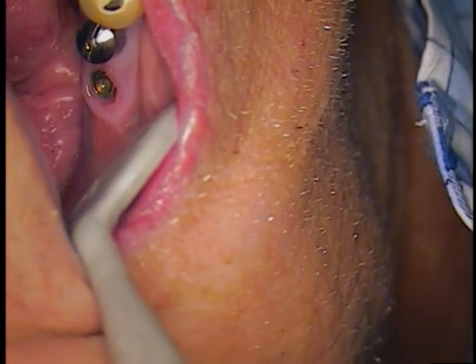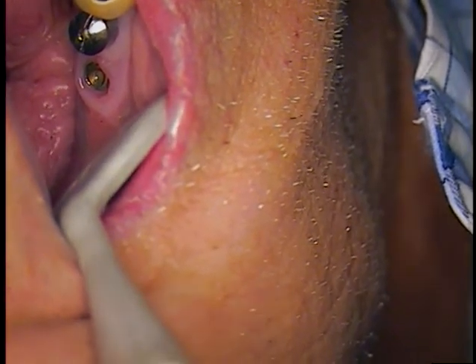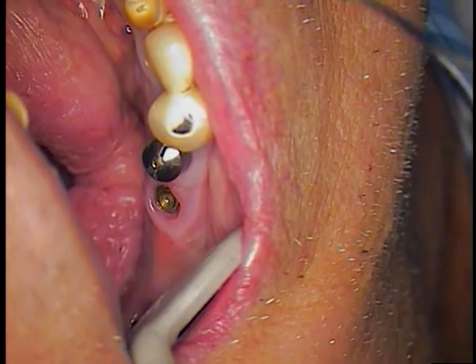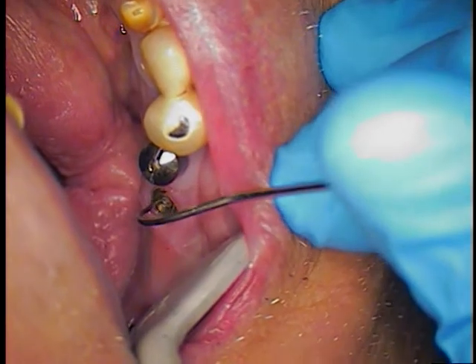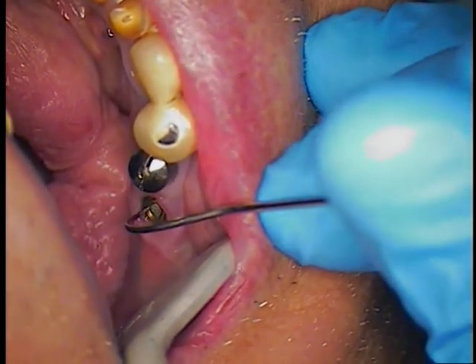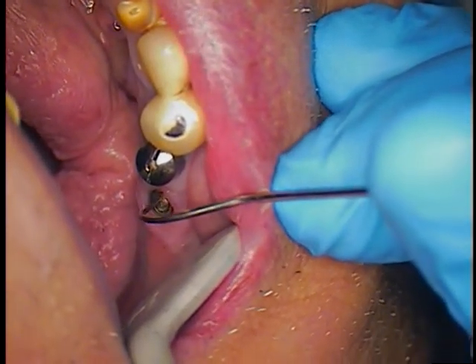We're back. I'm going to discuss where we are right now. We were successful in removing the broken tip of the screw, which was embedded all the way down to the base of the implant. Right now I'm on 29. I took care of 28 and I put a healing abutment on there — just any external hex healing abutment at a regular platform.